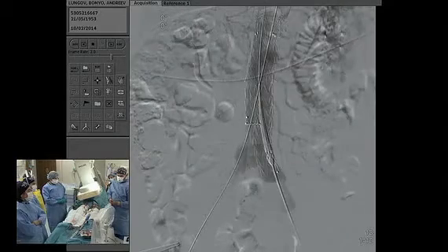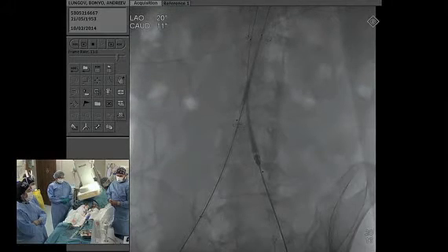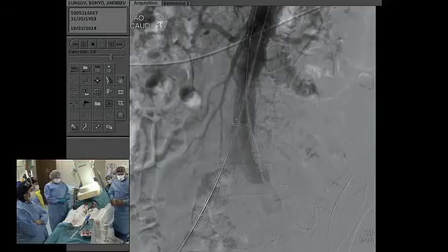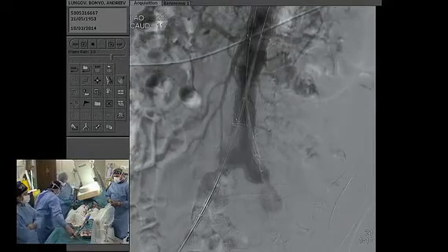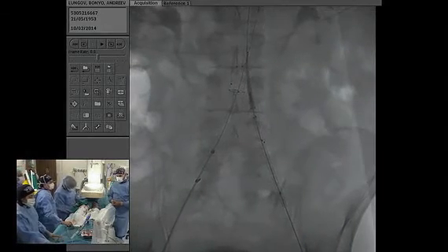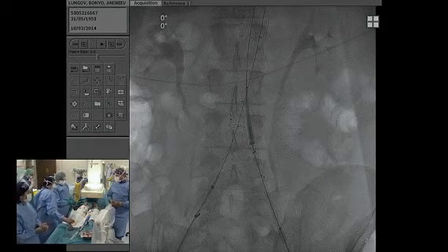Once again. Next, this is the angio before putting the right leg. Next. Here is the right leg opening. Next. And we can show you now the angio just before opening the left side iliac graft, and discuss what to do, to cover the hypogastric or not to cover. Like this. Okay, we are injecting now.